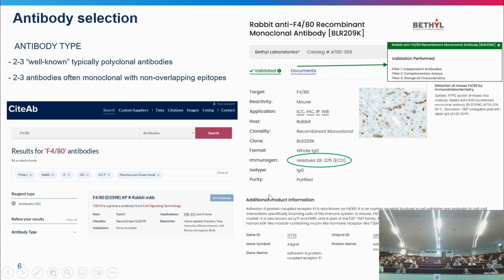This is a very good way to demonstrate that they have a full description of the protein. And what is very important for us, they show at least approximately where the epitope of the antibody is. We do rely on the paired antibody a lot, and we appreciate when vendors put this information. That is very helpful for us. You also see that the antibodies are validated, and if you press this, you will have the menu. These are the assays which were performed.